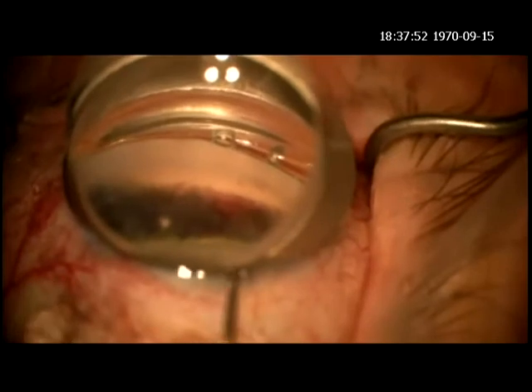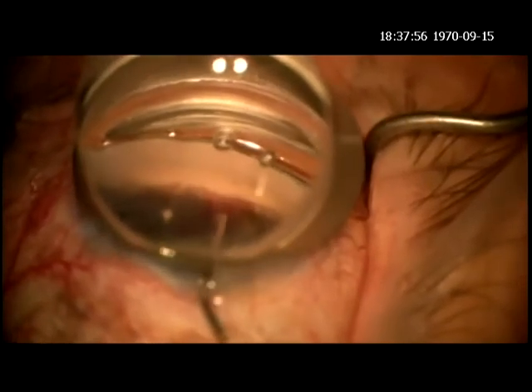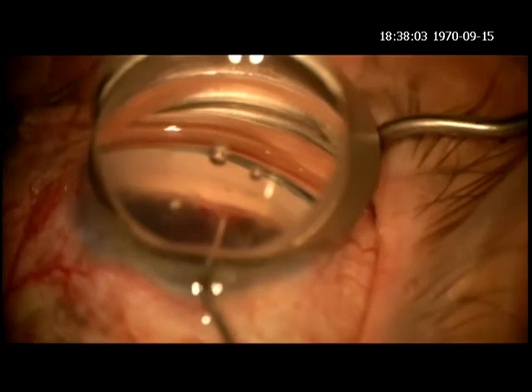So at this point, I'm going to put some more viscoelastic in, clarify the view, and there you can see the trabecular meshwork, and you can see what would be the ciliary body band, which is where I'm going to insert the Cypass.